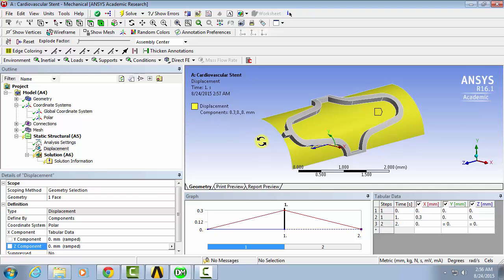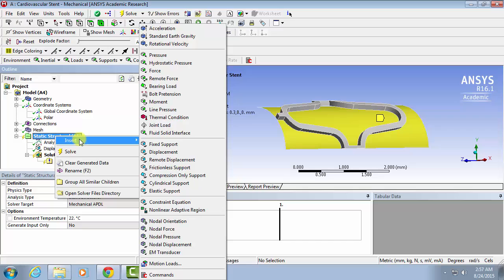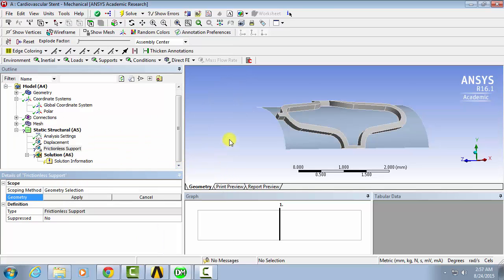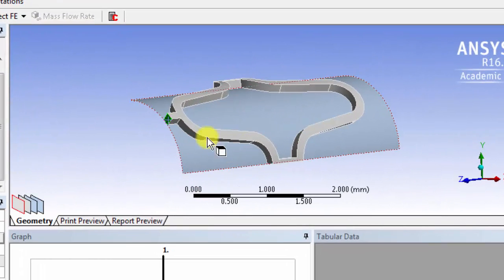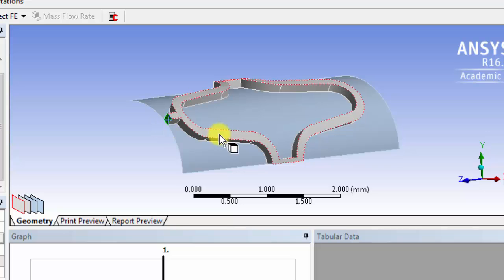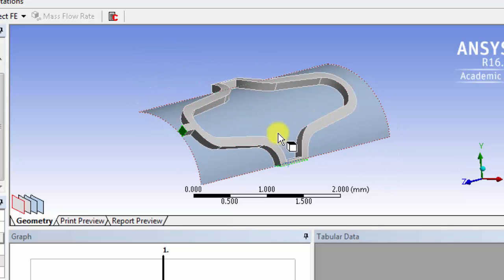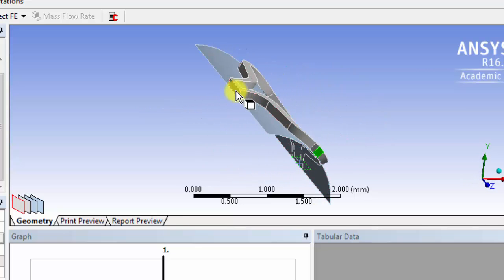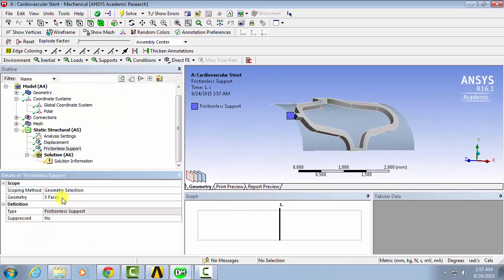Then to also constrain the movement of the stent, we'll insert a frictionless support on the three symmetry faces. So this one will limit it in the Z direction, this one will limit it in the Y direction, this one will limit the stent in the X direction. So we have all three directions. We'll hit apply.